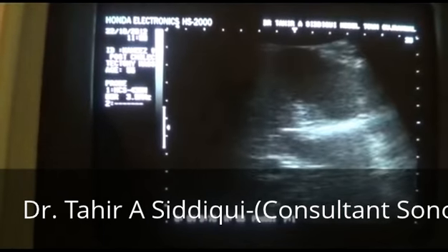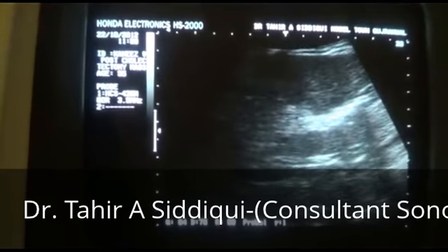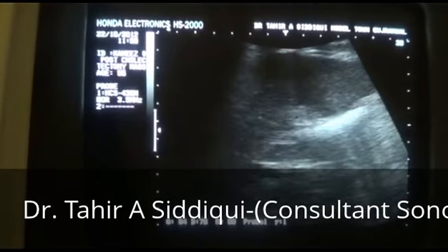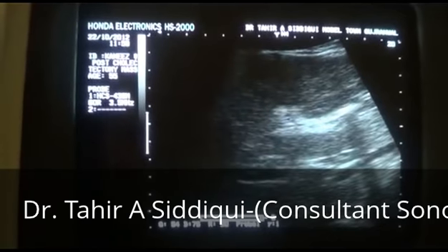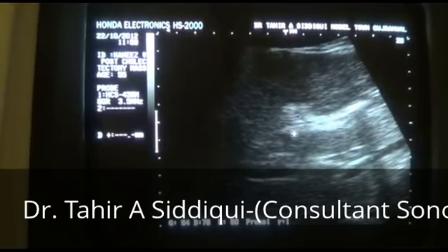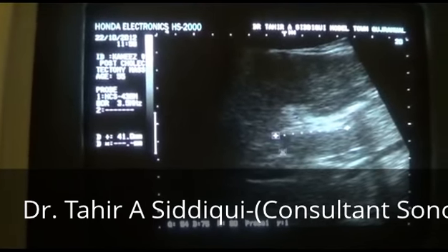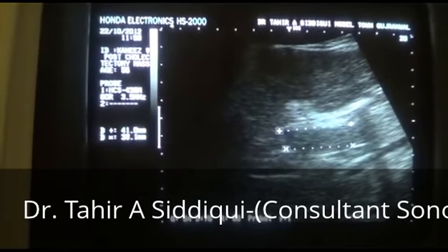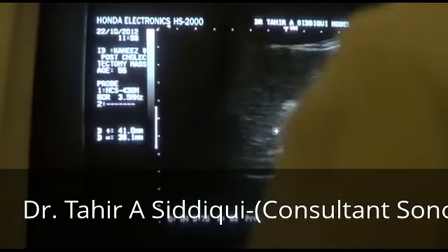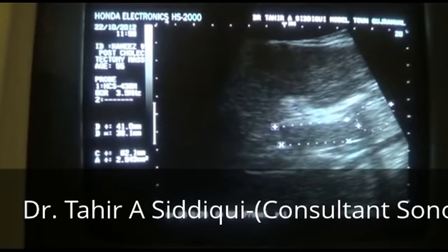And the CBD can be traced to its most distal end, and even at this stage, this is the portal vein and this is the common bile duct. It can be traced up to the inferior border of the head of the pancreas, which is this one. This is the head of the pancreas in longitudinal section.